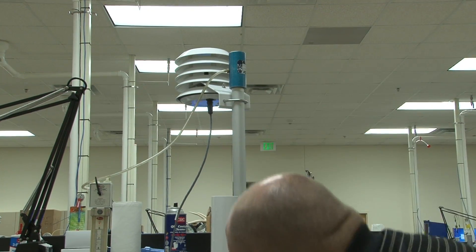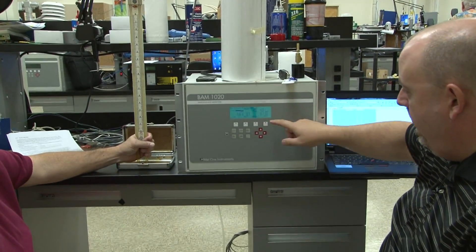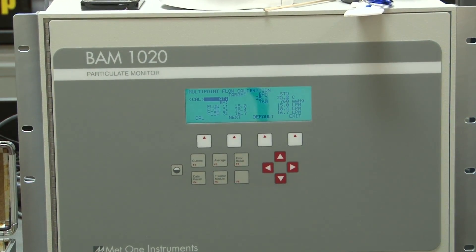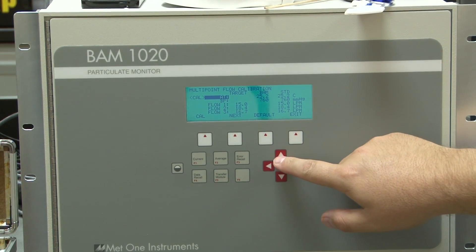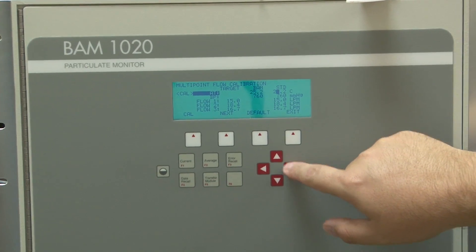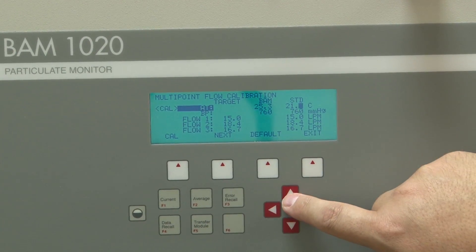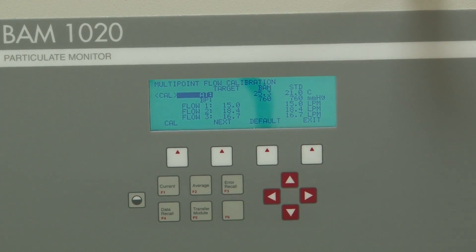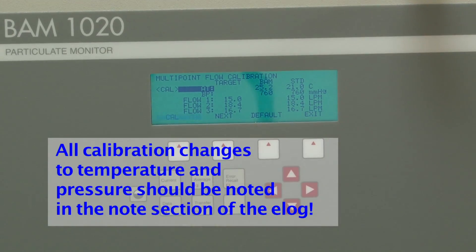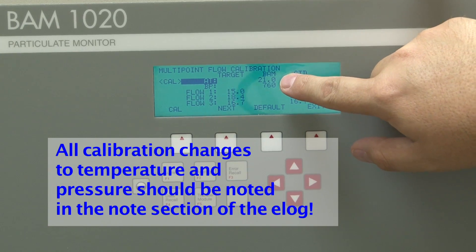Once you get a reading, come down here to the screen. For the sake of this presentation, let's say the temperature is 21 degrees. Use the arrow key to move over, directional arrow down, set it to 21 degrees C, and hit Calibrate. You'll see that the BAM is now calibrated to 21 degrees.